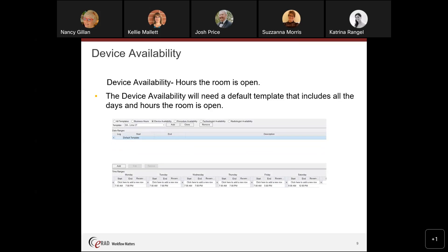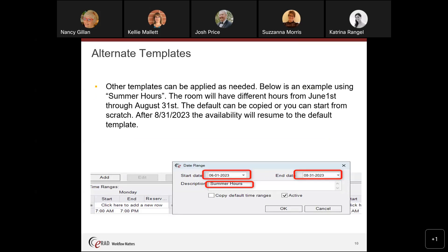Here you can see that the device availability matches the business hours, which is helpful because you can clone templates to make configuration easier. Even if you just have to go back and change one time slot, cloning is much easier than building from scratch. You can also have alternate templates applied as needed — for example, summer hours. A room can have summer hours active from a start date through August, and on September 1st that template expires and the regular default template takes over again.